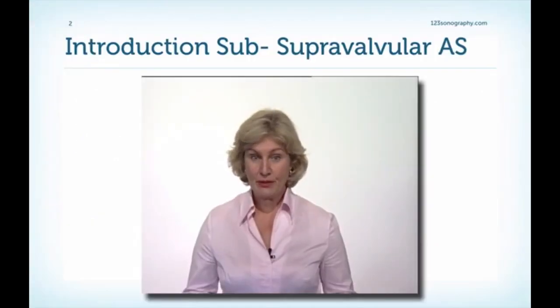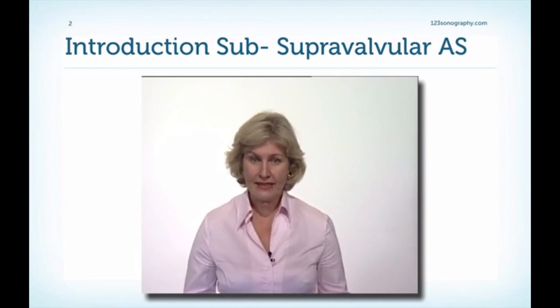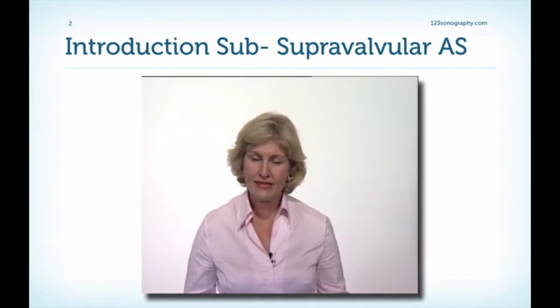In the next chapter, we will talk about sub and supravalvular LVOT obstruction. It's a rare condition in adults, but it's important to remember these findings because they should not be mistaken for severe valvular stenosis, because the treatment is completely different.